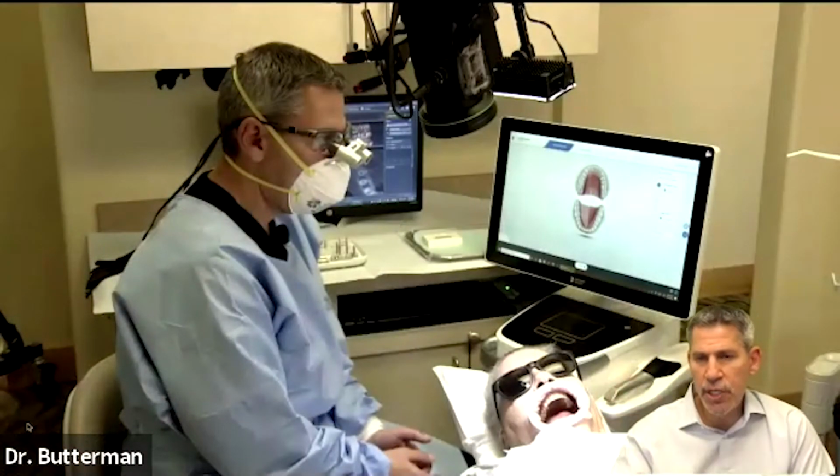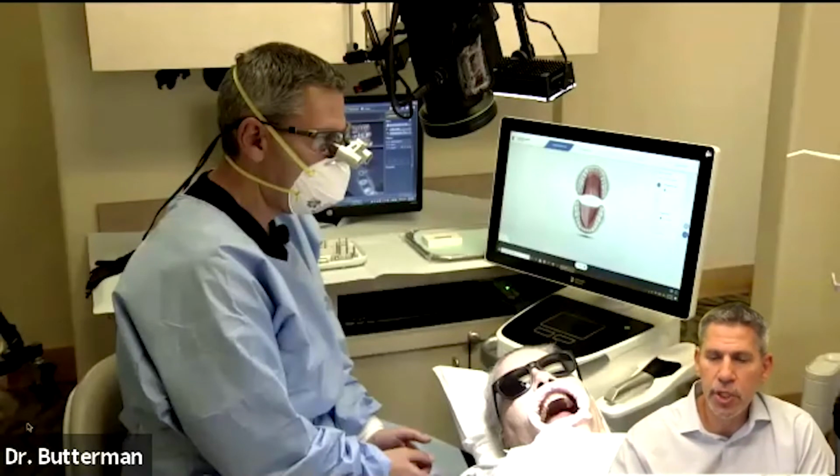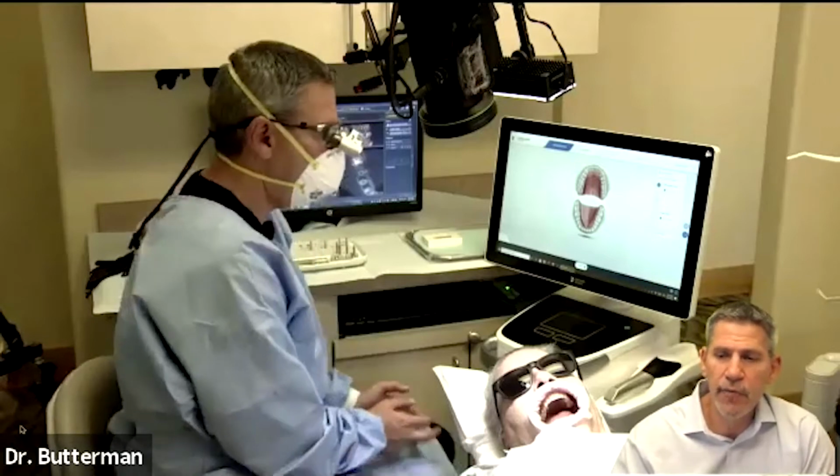This is the same patient I did surgery on, and now the patient is returning to scan for the restoration after healing. I generally go with an Astra EV implant. I'm generally about 8 to 10 weeks out for that.